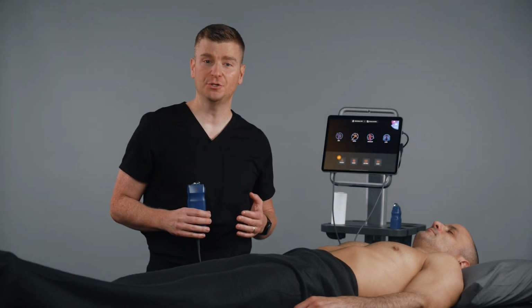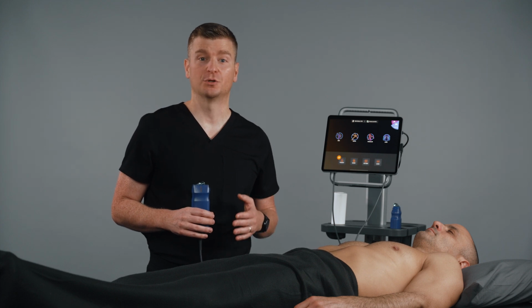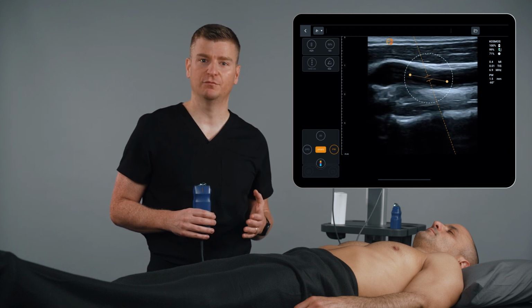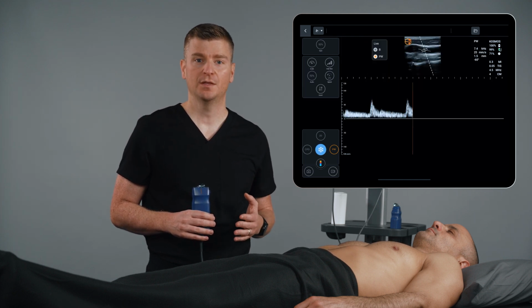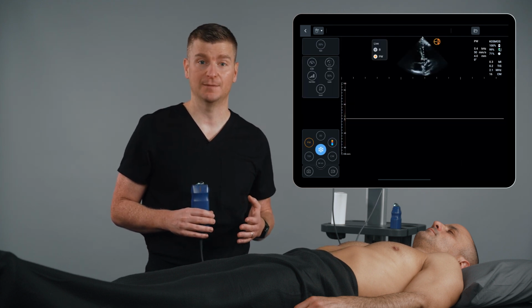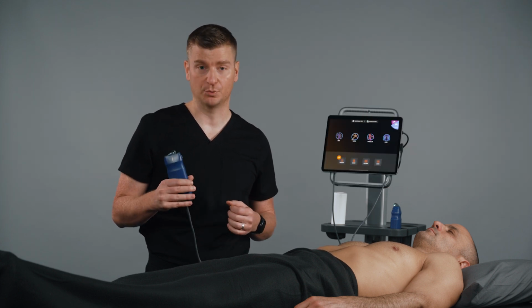I'm going to show you how to use pulse wave Doppler, also commonly known as spectral Doppler, on your Kosmos system. Pulse wave Doppler, or PW Doppler, helps you analyze blood flow from specific locations in the heart and vessels. This feature is available with both the Torso-One probe and Lexsa probe in the heart, abdomen, and vascular presets. Right now we're using the Lexsa probe.